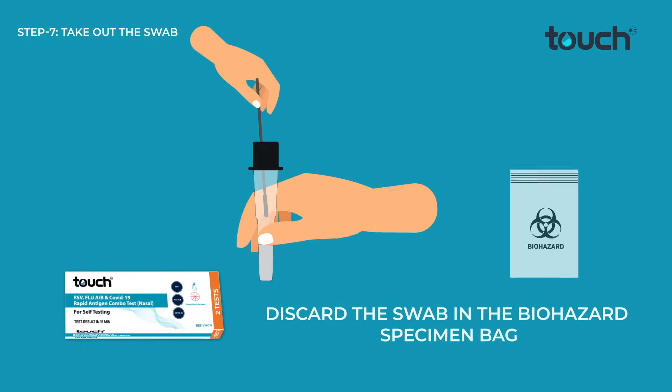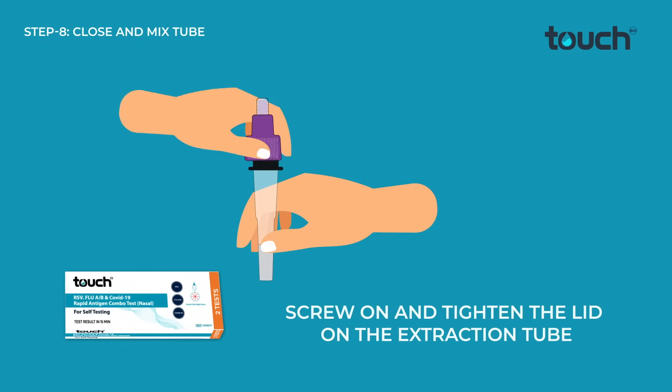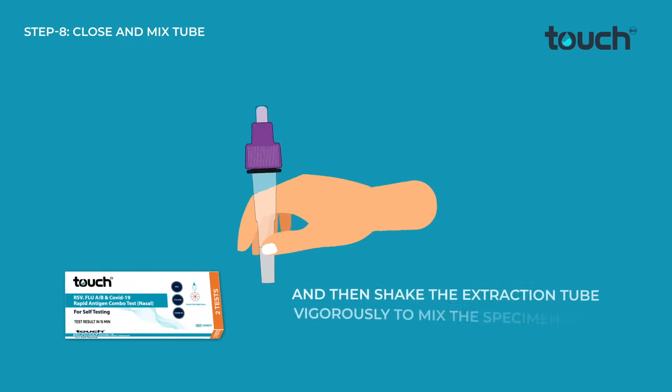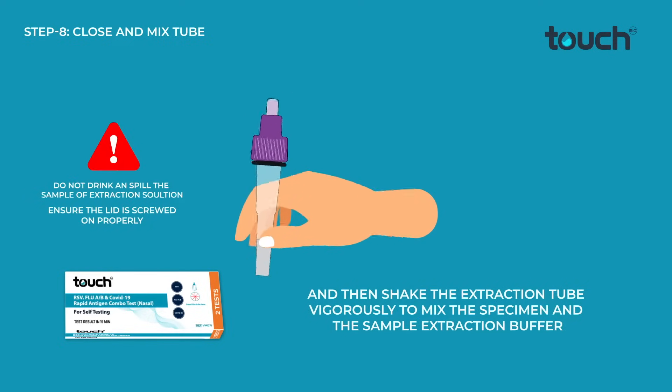Discard the swab in the biohazard specimen bag. Screw on and tighten the lid on the extraction tube, then shake the extraction tube vigorously to mix the specimen and the sample extraction buffer.